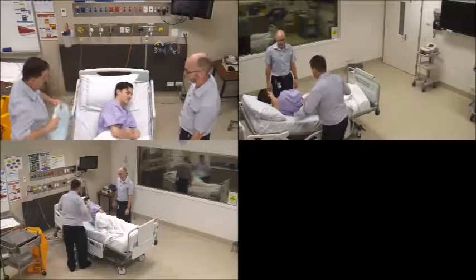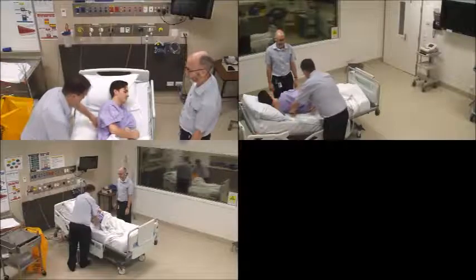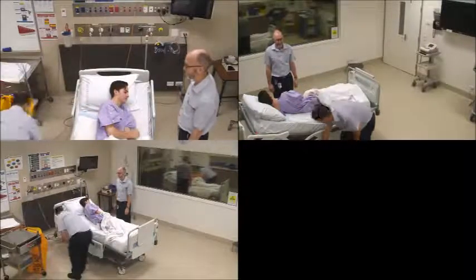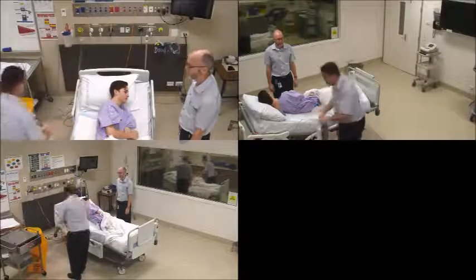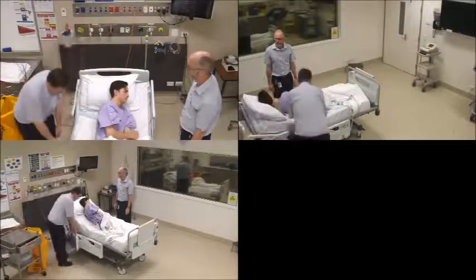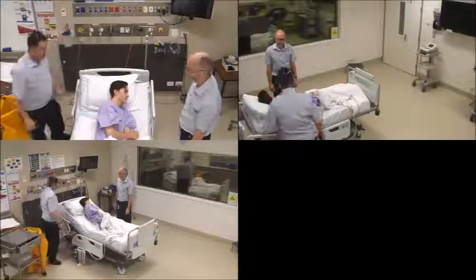That's it. Okay. The bluey is basically just here to protect your clothing. Well, it's one of our hospital gowns, but it's just there in case we get any leakage. Okay. There is about 1,530 mils of liquid in the drain, and we'll just turn this suction off. Okay, let's get you ready.